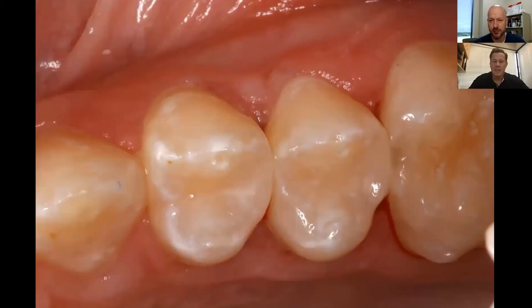Looking at the final restorations — those marginal ridges and the color — really a nice job. It's nice to be able to finish those the way they do without a lot of excess overhang. That's really where it establishes your efficiency, because with composite-based dentistry, we're looking for a nice high-quality finish. We're past the amalgam days, where amalgam was never pretty, so the bar is now set higher. With a proper matrix and band in place, you can certainly minimize a lot of that excess finishing work. For me, this is a two-step polishing system — one and done. I want to do great dentistry, but I want to do it as fast as I can.